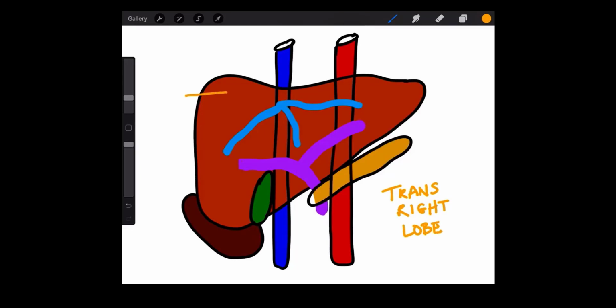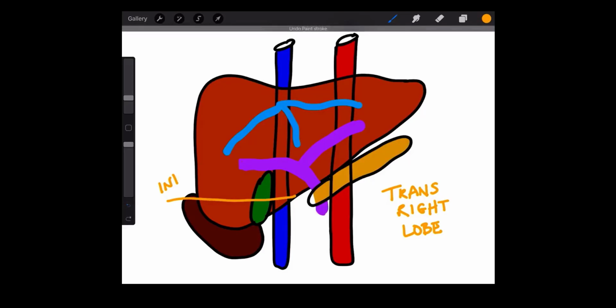Our first image on the right lobe is going to be of the dome. We want to be way above all of the blood vessels, getting that very tippy top corner of the right lobe. Moving inferior on the body then, we are going to stop at the level of the hepatic veins as they empty into the IVC. Moving again inferior, we're going to take a look at the right lobe of the liver at the level of the portal veins. And then lastly, we'll move to the inferior tip of the right lobe of the liver, looking at, again, the interface between the right kidney and the right lobe of the liver.